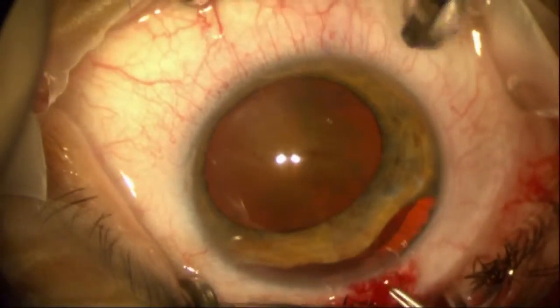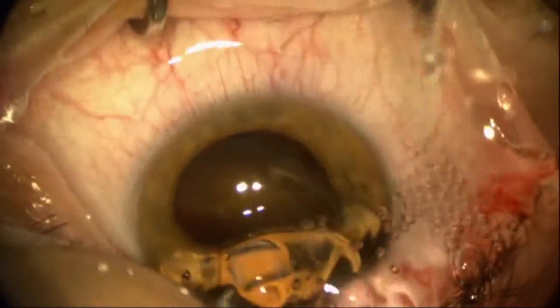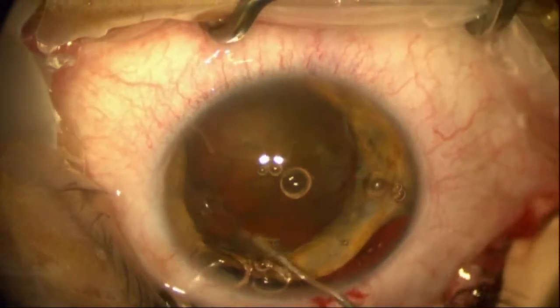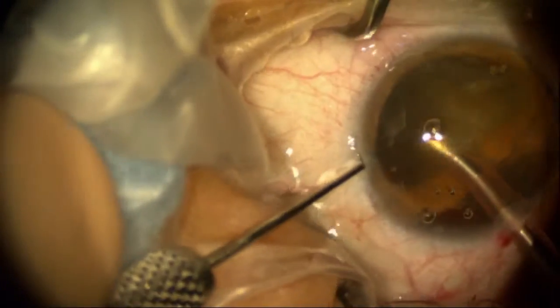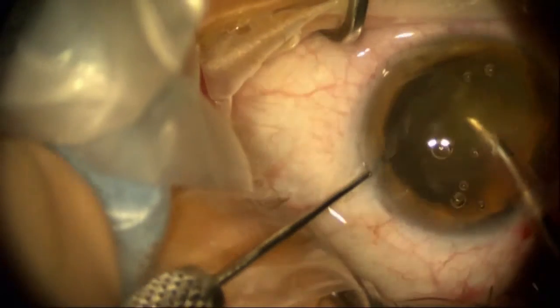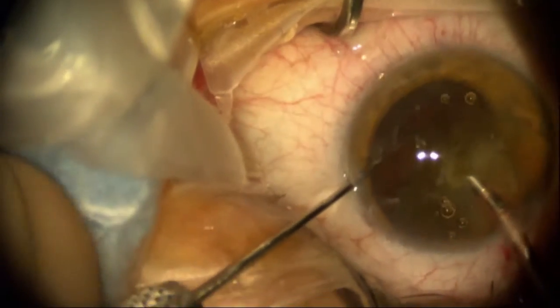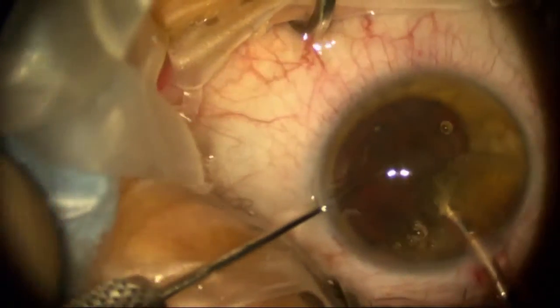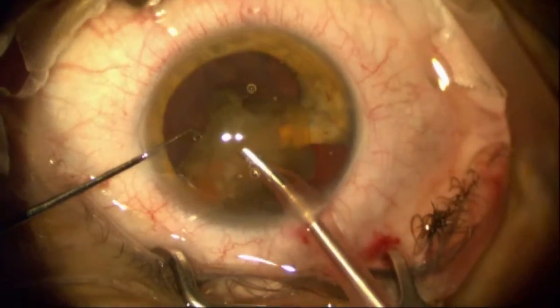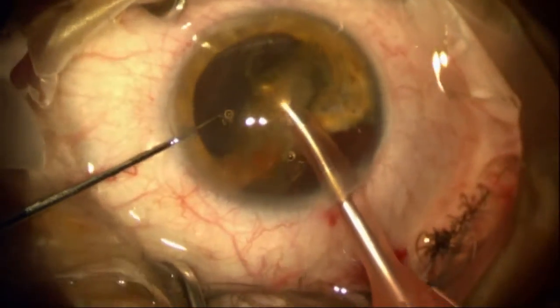Doing a full capsulorhexis here. I'll do a little more aggressive hydrodissection so that I can avoid a pop-and-chop technique and avoid risking injury to the iris. Using a combination of cohesive and dispersive viscoelastics, keeping the iris out of harm's way by manipulating the lens and using a chop technique — removing the rest of the lens material without injuring the iris.